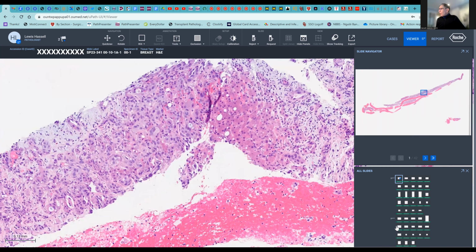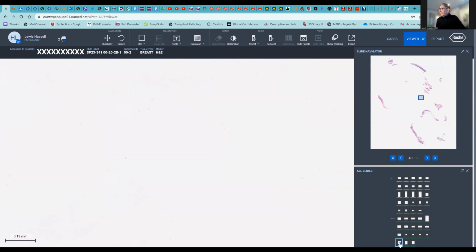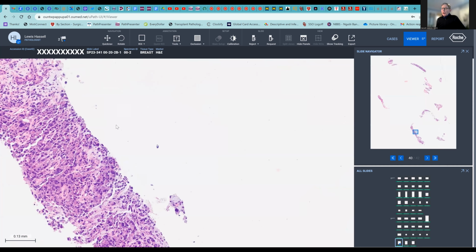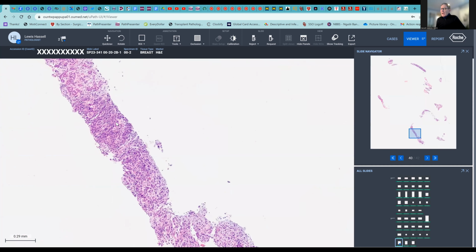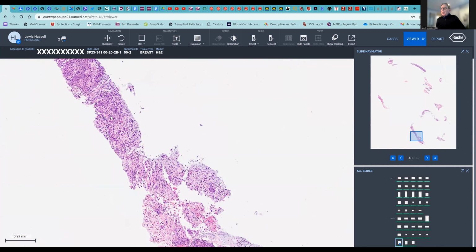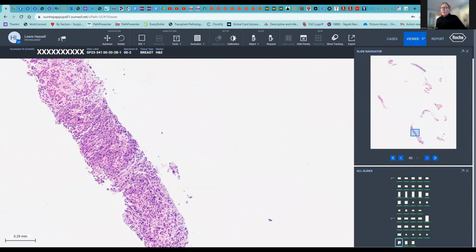So then going forward and looking at the pancreas biopsies, we saw a somewhat different picture in this site. So here we see a very, very high-grade tumor with some background pancreas tissue, but a very cellular stroma. So this is not the usual picture of ductal carcinomas of the pancreas, which tend to be rather paucicellular, have a lot of desmoplastic stroma, but don't have this very cellular appearance.